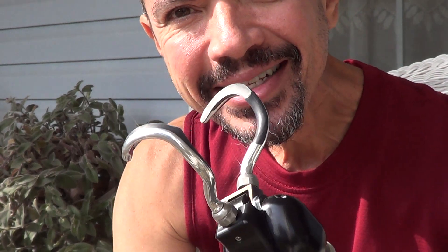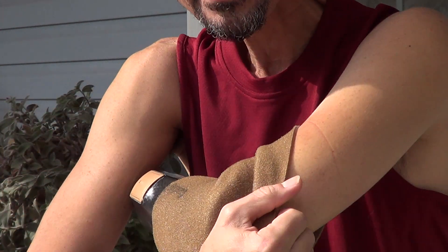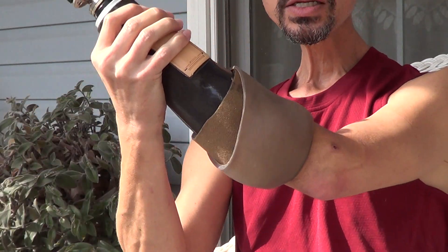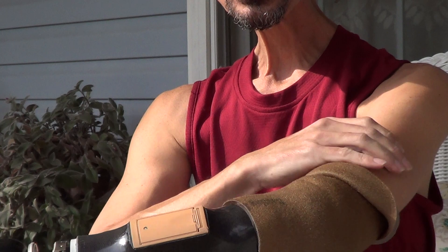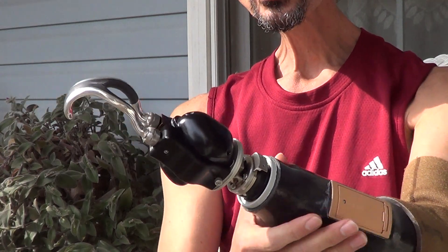I've got some practicing to do, but this is it. I'll show you how I take it on and put it off. I just pull the sleeve down and pop it off. Getting it on is a little harder — let's see if I can do it right. He gave me some silicone that I can put on my arm to make it more lubricated to slide in there.